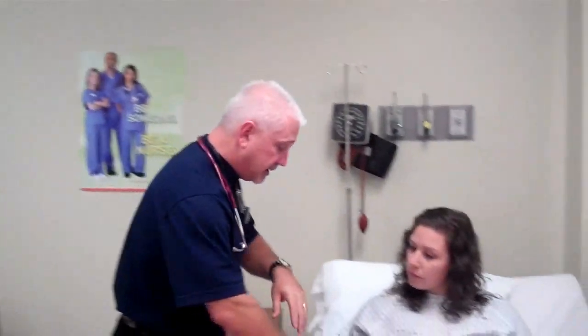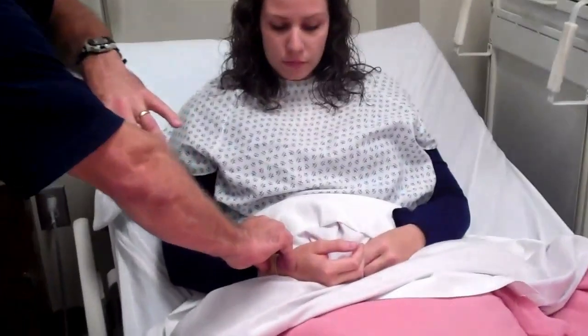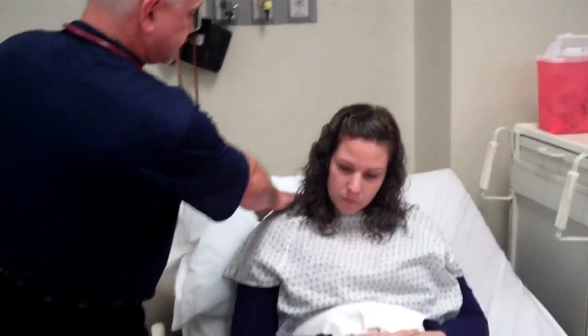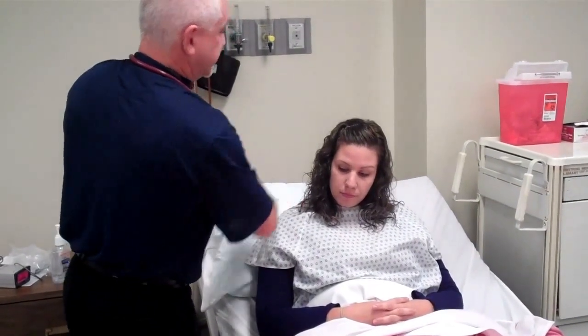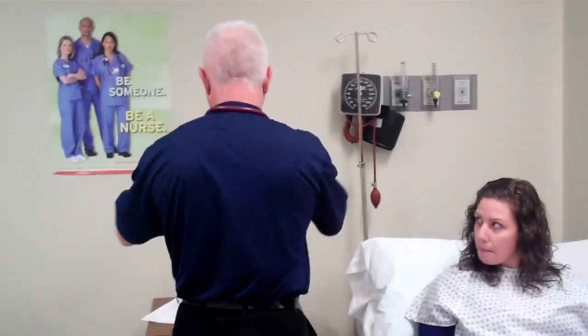At this point, I would check the patient's heart rate, respiratory rate, sat, color, level of dyspnea. Heart rate I'd check by getting a pulse. Respirations, I'd look at the patient, and I'd count for 15 seconds and multiply that by 4. I'd get her saturation by using what we call a pulse oximeter.